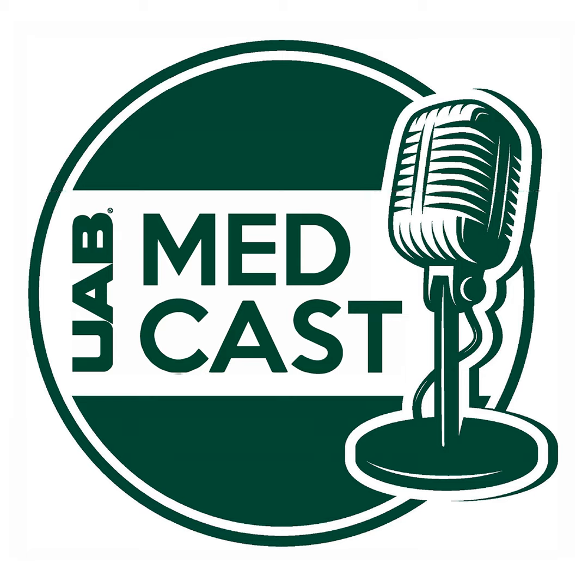And I'll also add that these are just great options for patients that simply don't have enough bone too. There's another type of implant called a zygomatic implant, which we do, which is kind of a longer version of the regular implants we think of, but they're really only able to be used on the upper arch. But I personally think that this new option, the subperiosteal implant, offers a better prosthetic solution and surgical solution for these patients.